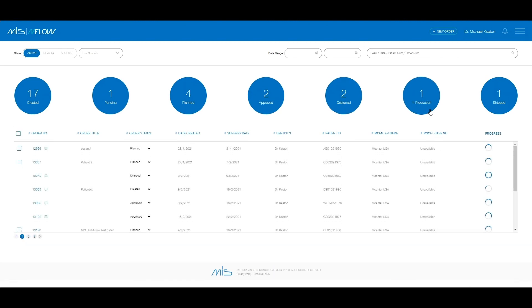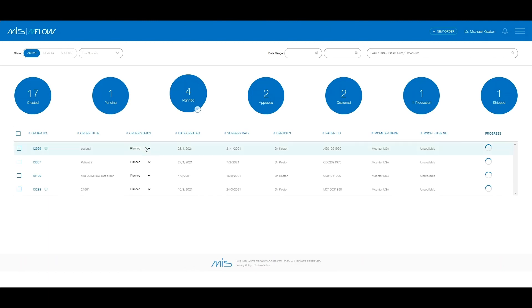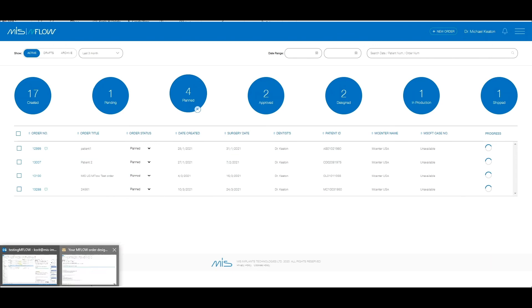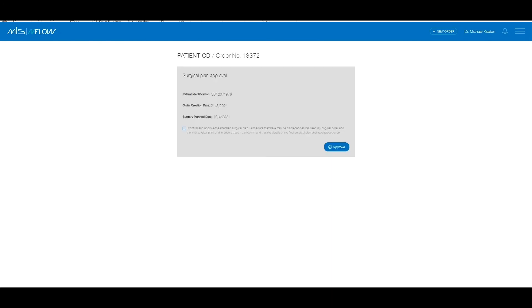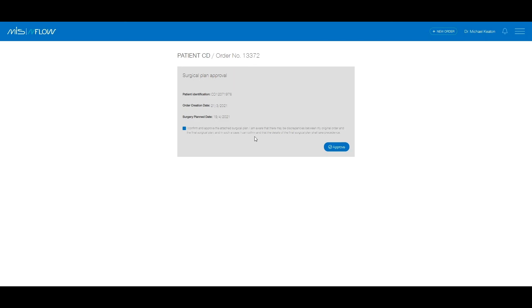If you mailed in a physical model, your order will move to Pending until the shipment arrives at the mCenter. Once you have reviewed your plan with the mCenter technician, you will receive an email prompting you to log in to view your order. Review the final surgical plan and approve it. This is a mandatory step so that the guide can be designed.